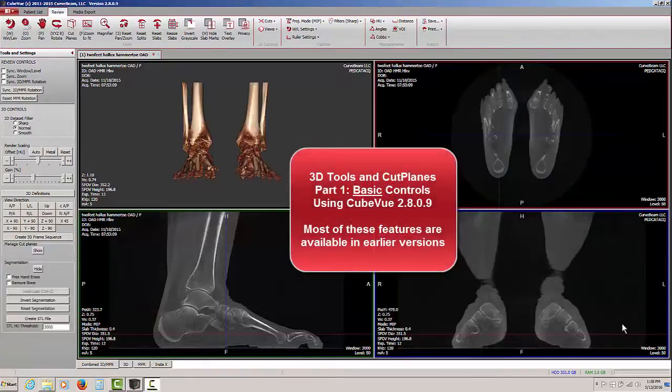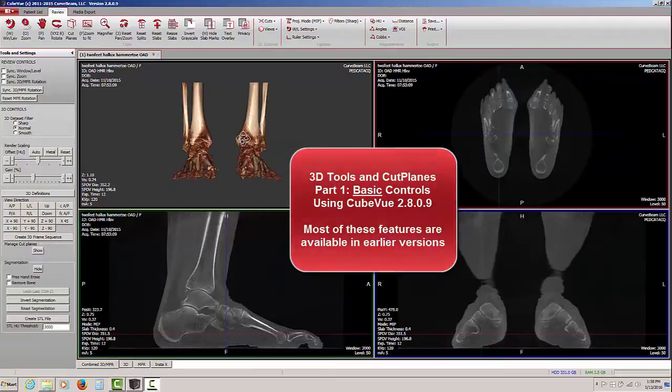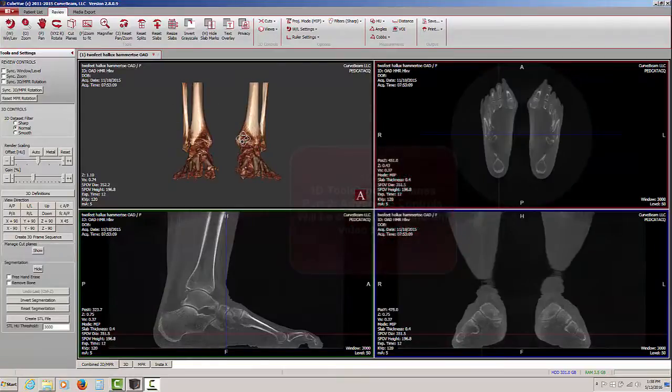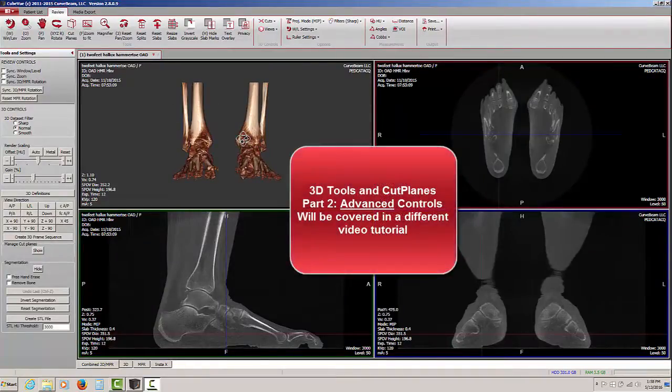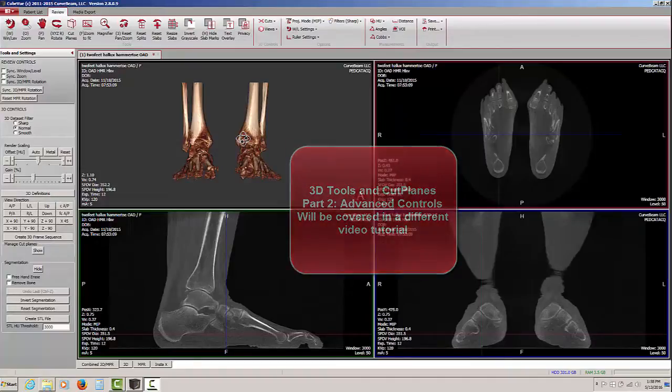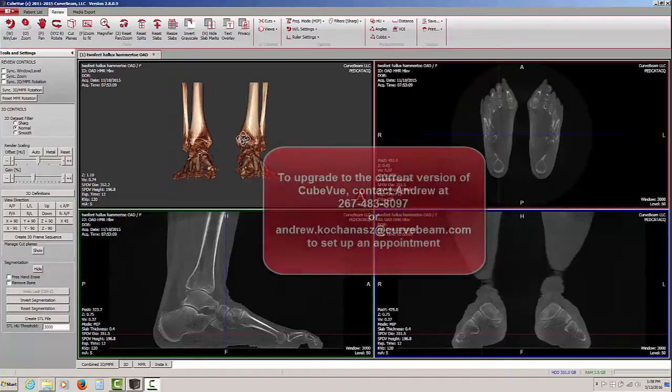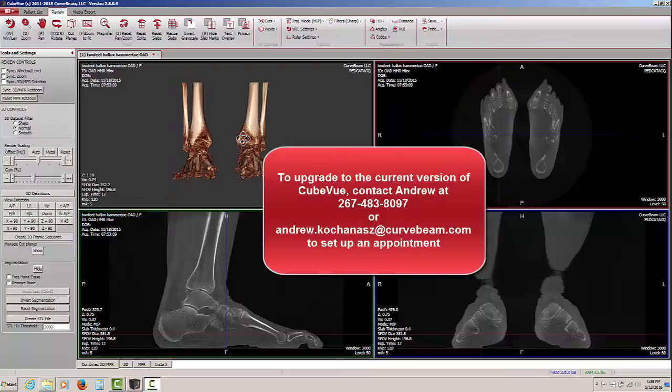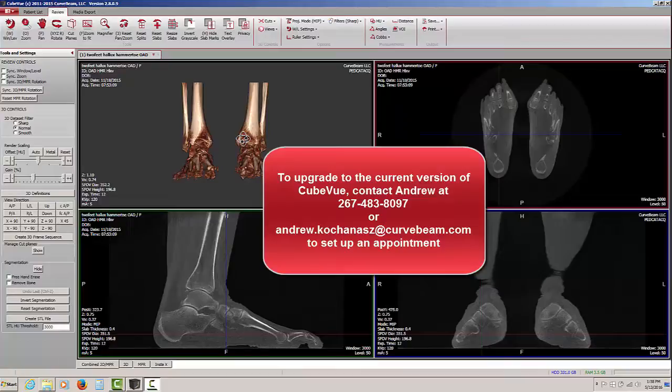This concludes the basic controls for the 3D rendering window. There will be an additional video created for advanced controls for the 3D rendering window as well. This video was recorded on CubeVue version 2.8.0.9. If you would like to upgrade to this version or whatever the current version of CubeVue is, please be sure to contact CurveBeam technical support to arrange an appointment to have your system updated.